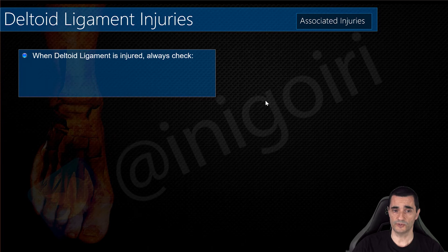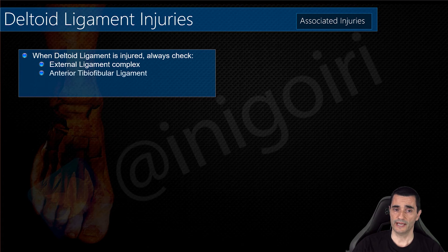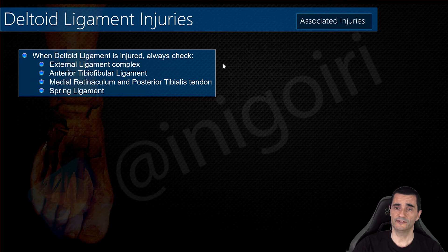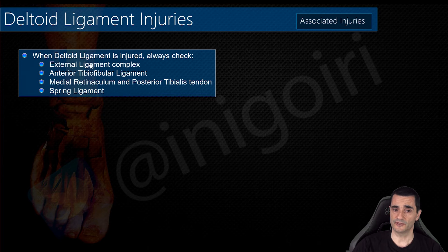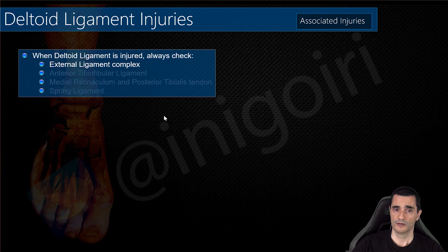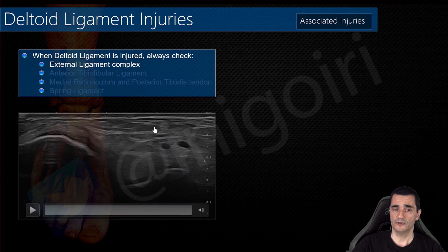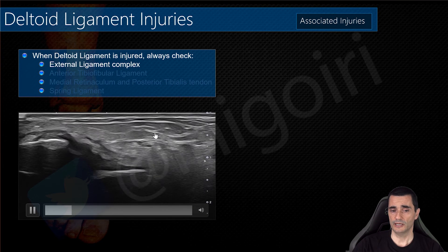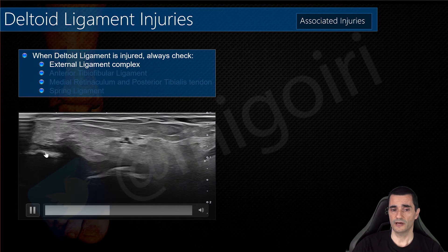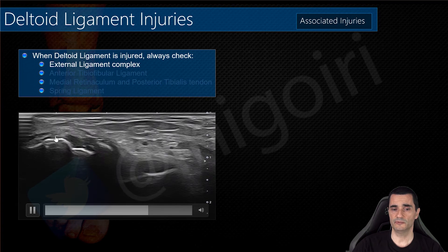Now we are going to check other associated injuries. When we detect an injury of the deltoid ligament, we always need to check the external ligament complex, the anterior tibiofibular ligament, the medial retinaculum, the posterior tibialis tendon, and the spring ligament — all these structures must be assessed. Here is an example of a medial collateral ligament injury with affection of the anterior talofibular ligament.